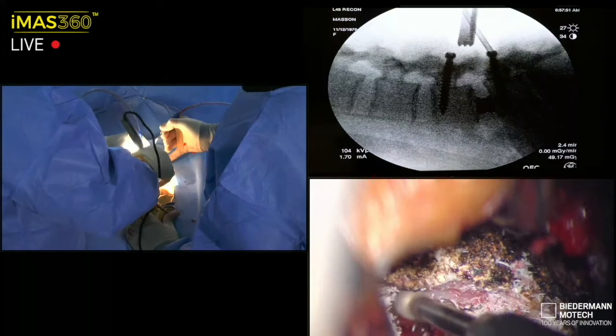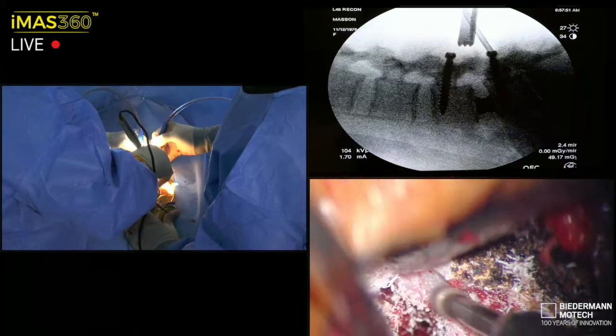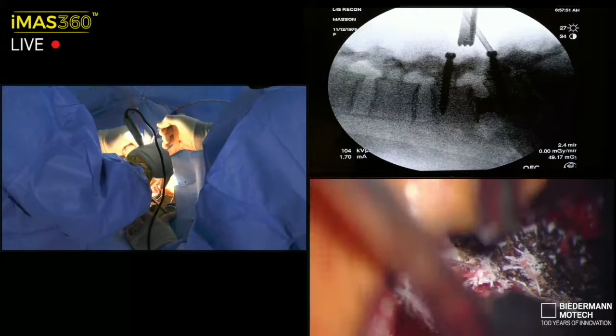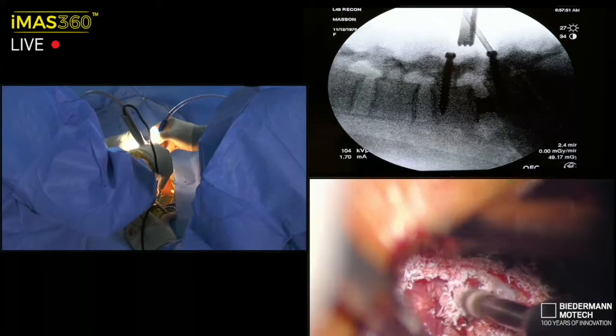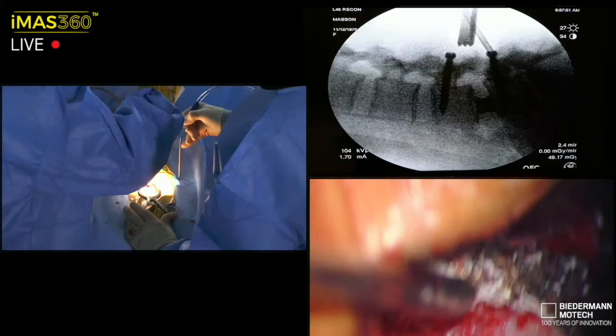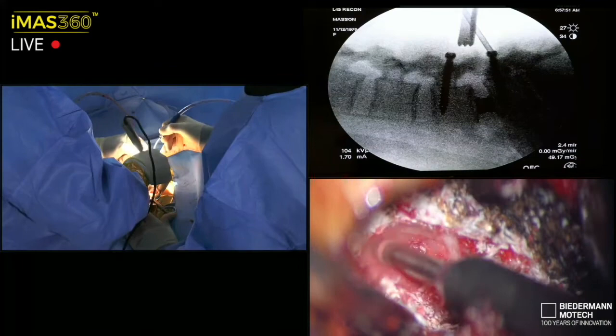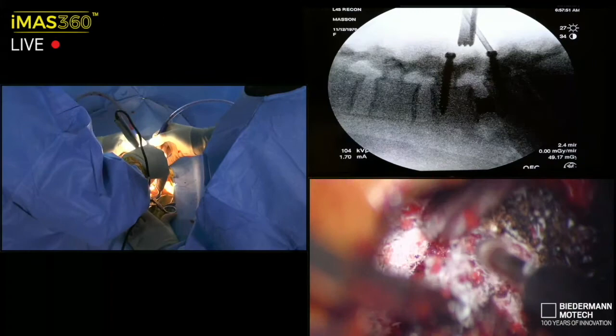So we'll come up lateral to medial, continue to think of this as a lateral to medial approach, knowing there's a lot of dorsal midline scar. No need to engage the scar. We're reconstructing this person, so we can easily take the facet all the way to soft tissue. Part of it is visual, part of it is feel. I usually feel before I see. So it's very much important to paint and wand, not plunge. There's no gouging. Just gentle painting.